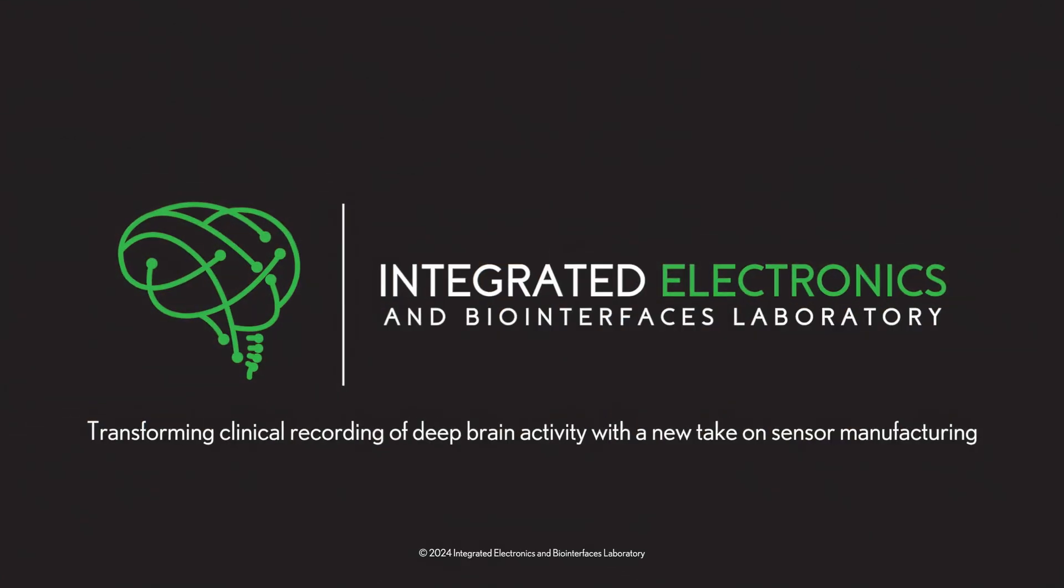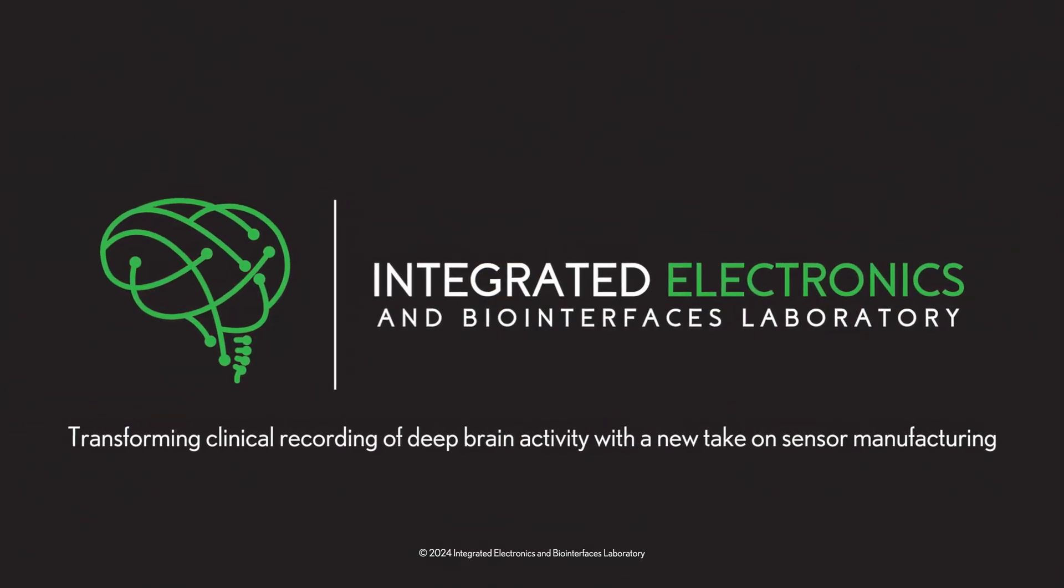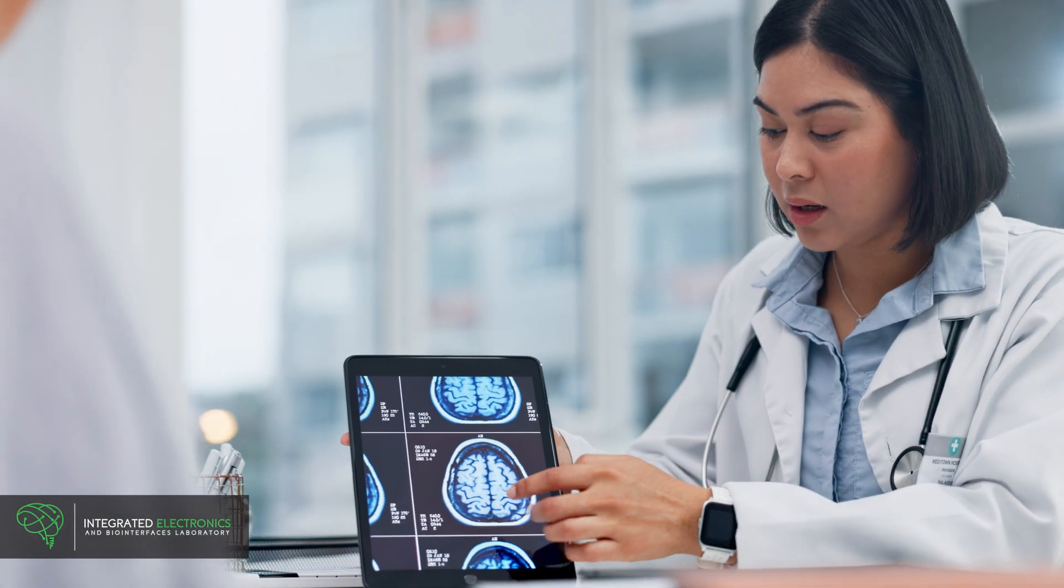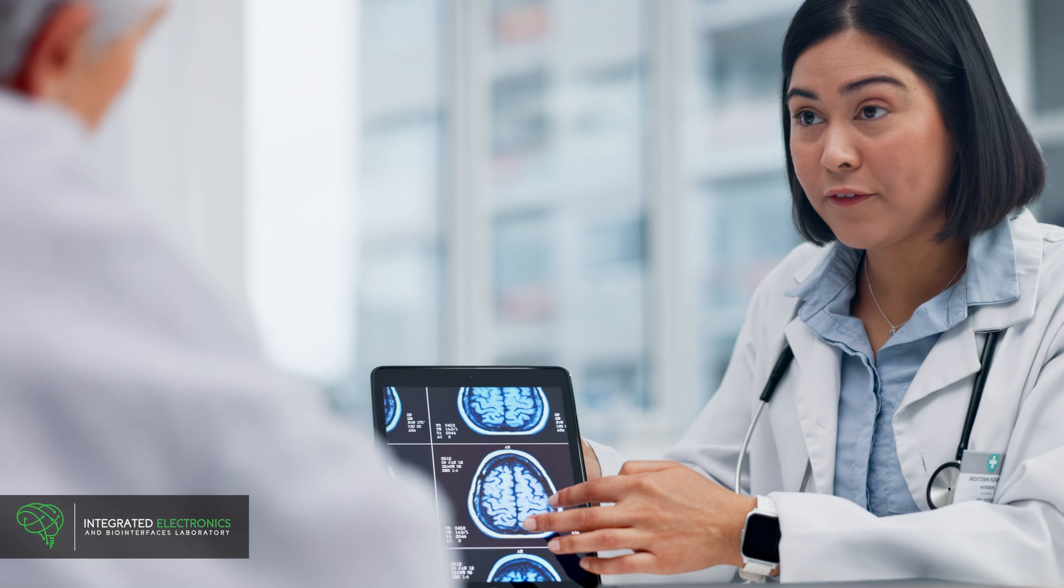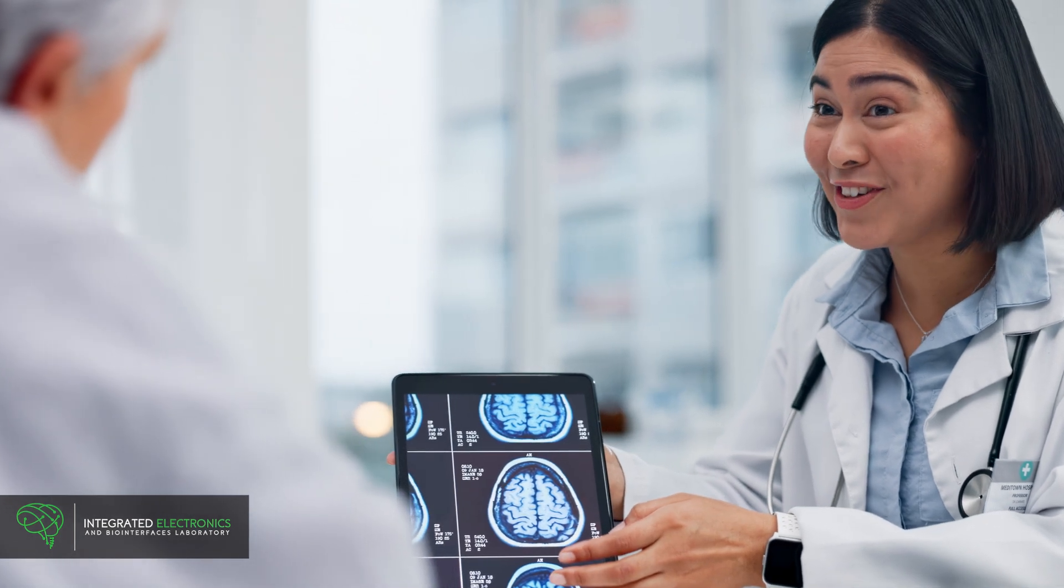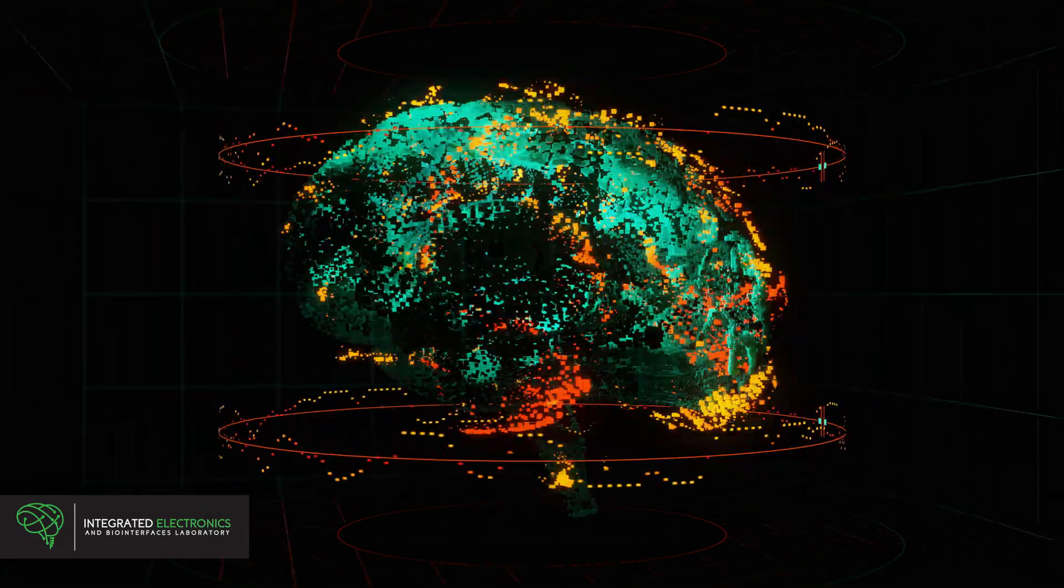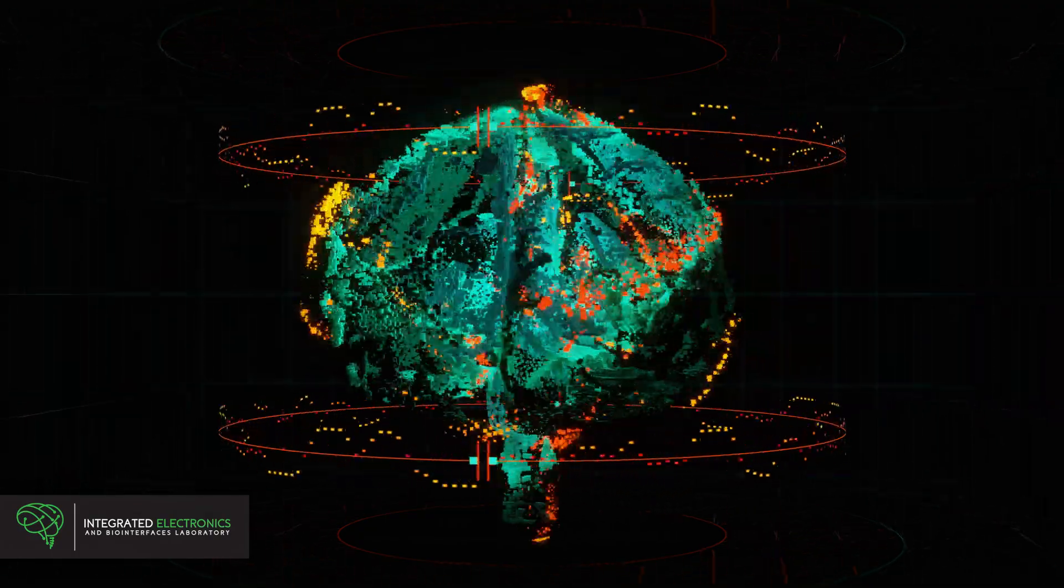Every year, hundreds of thousands of patients worldwide who suffer from neurological diseases and disorders, including Parkinson's disease and treatment-resistant epilepsy, opt to have hardware implanted in their brains. The implants monitor and sometimes stimulate the brain to address serious health challenges by modifying brain activity.